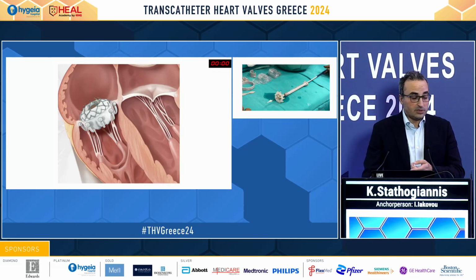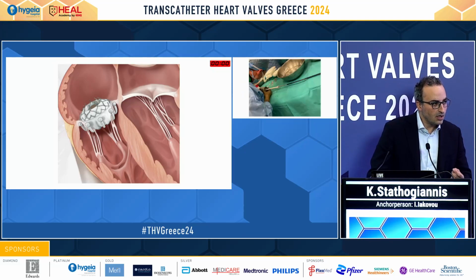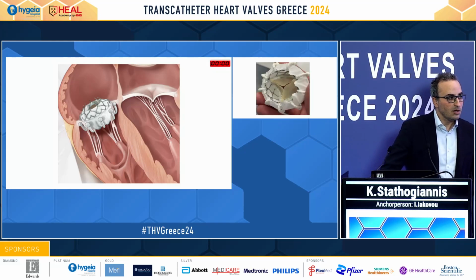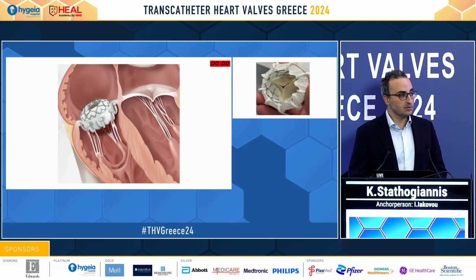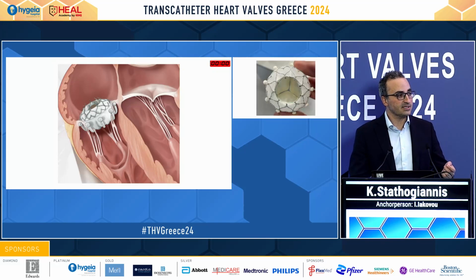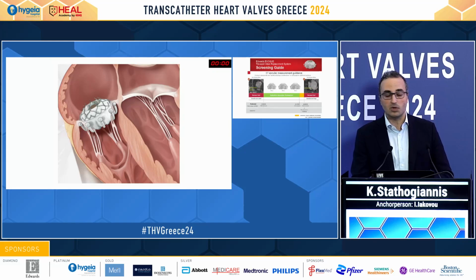Now, you said what will happen if the valve eventually would degenerate? I couldn't hear you, sorry. Yes, but the pacing wires. So what happened with the pacemaker? We didn't have any issues. We know from the studies there have been some side effects, some conduction abnormalities. We did have one, but it went off by itself within a few seconds. Otherwise, no, we didn't have any problems with patients with pacing wires.